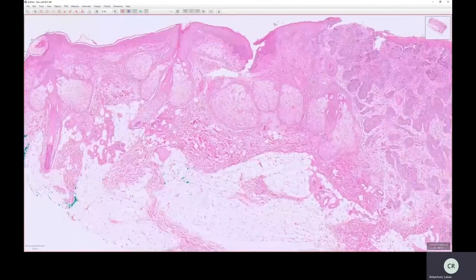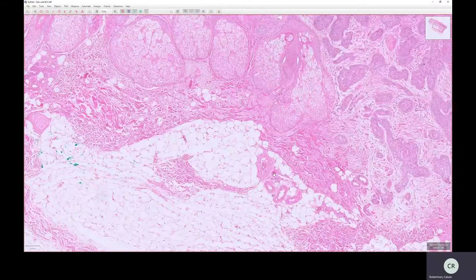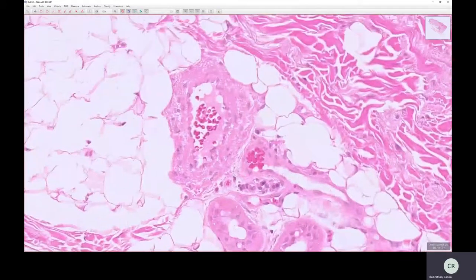So really, that pretty much covers most things. One thing I haven't covered so far probably is blood vessels themselves. So let's just zoom in here and have a wee look at some blood vessels. You get different types of blood vessels. You get arterioles or arteries. They're all part of the arterial tree that takes oxygenated blood from the heart to tissues. And you can tell arterioles away from the other main type, which is the venous tree, or venules if they're small, and veins if they're big, because of the thickness of the wall.